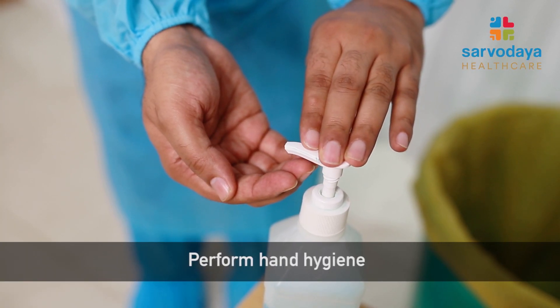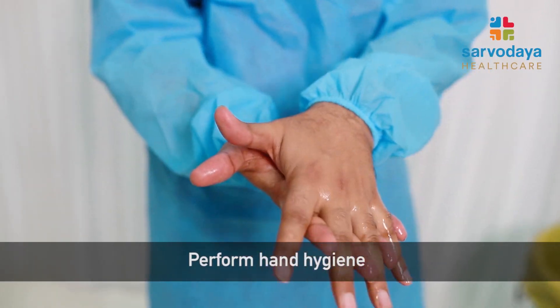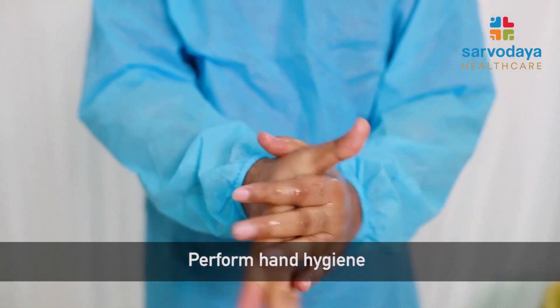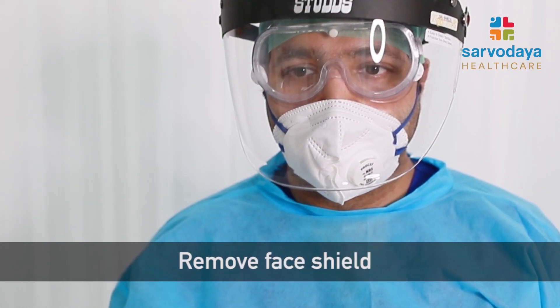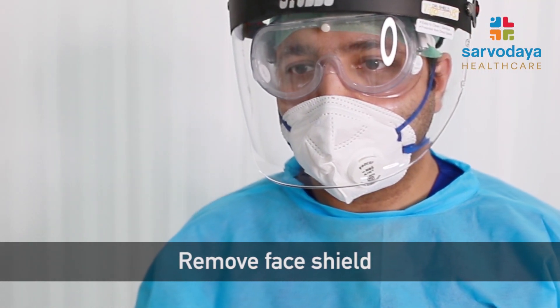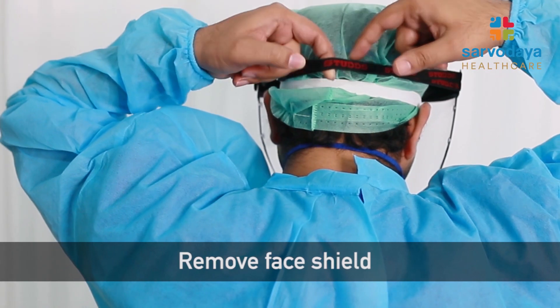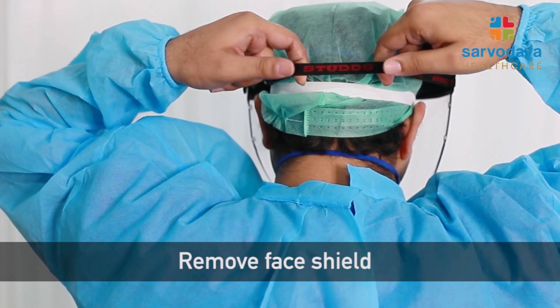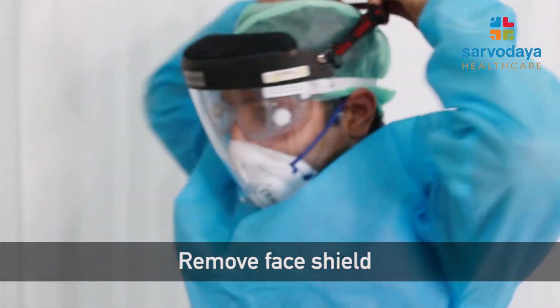Once the gloves are removed, we need to perform hand hygiene with the help of a sanitizer. Now we will remove the face shield. To remove the face shield, we need to touch the non-contaminated surface, that is the back strap of the face shield. Gently pull the strap and remove it, then discard it in the bin.